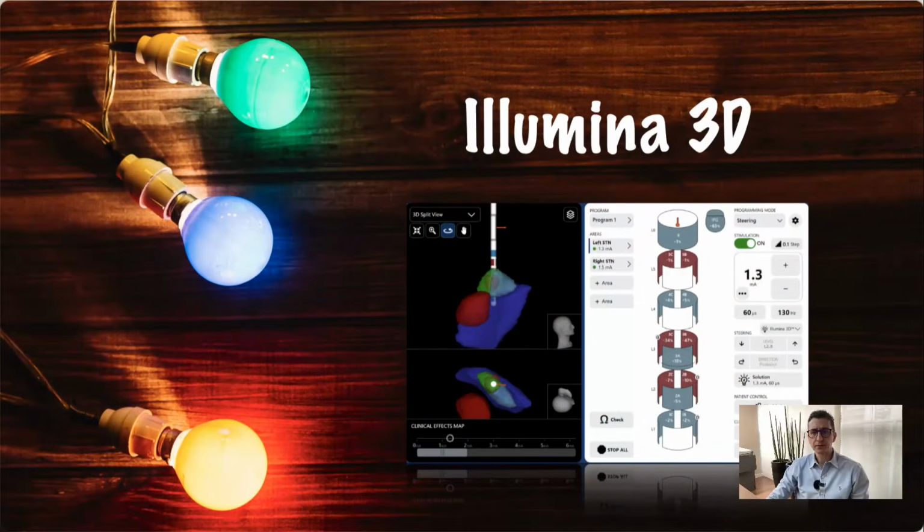And again, when we say Illumina 3D, it is this software. Imagine that here you have the STN in green, as you can see, and you ask the software, where should I put my cathodes? And the software will say, okay, you have to put them here, here, here, here.